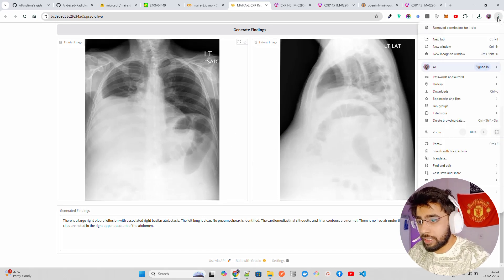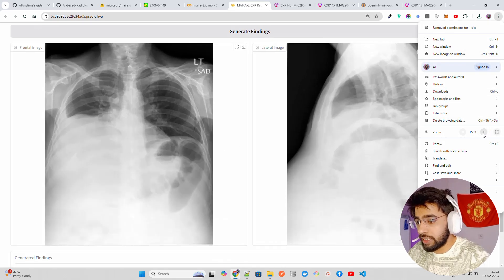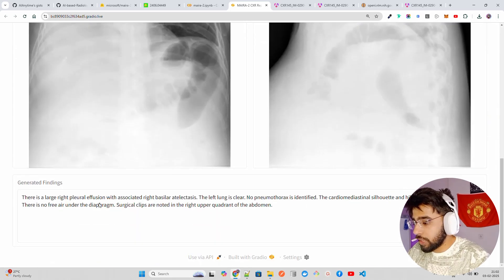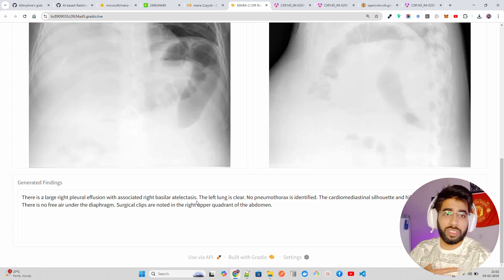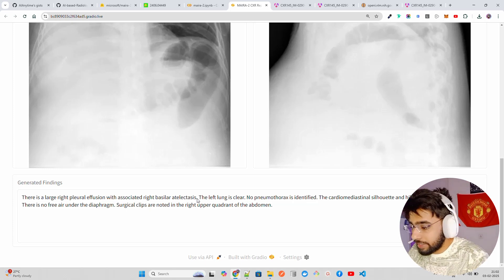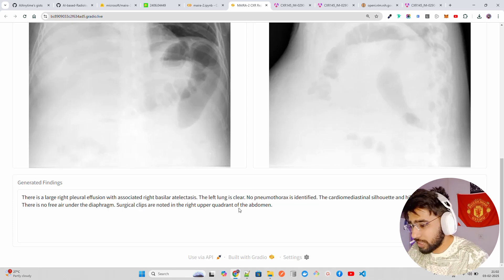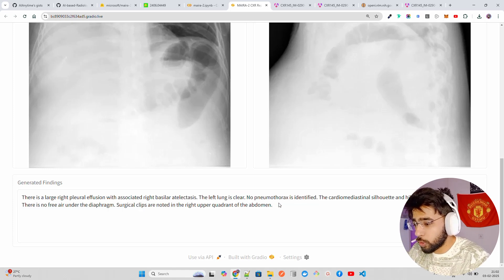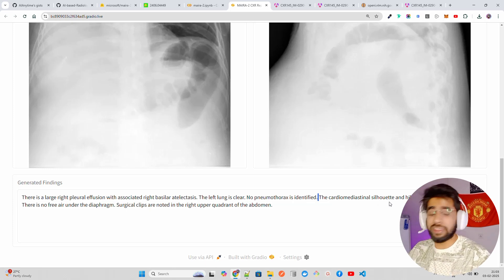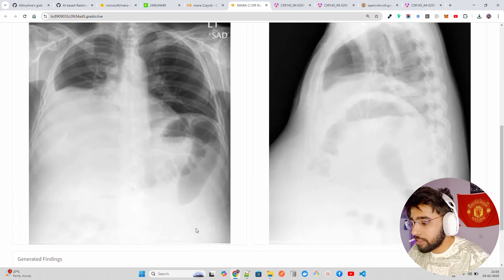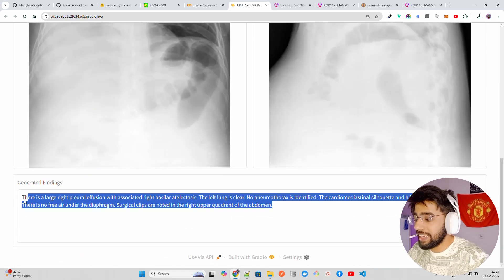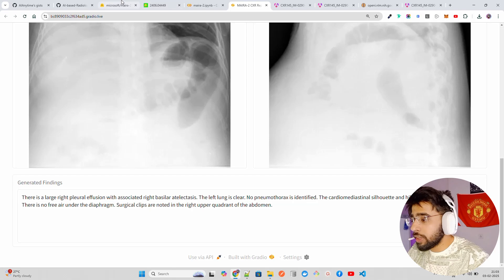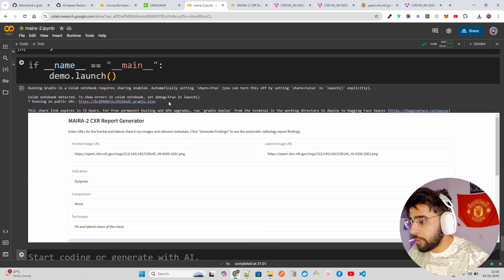If you look at the generated findings, I'll make it a bit larger for you so you can read it. You can see it says there is a large right pleural effusion with associated right basilar atelectasis or something. The left lung is clear. No pneumothorax is identified. The cardiomediastinal - it's very difficult to pronounce - but it gives you some findings. You can again increase this in your code. We have 450 max new tokens, if you need grounded generation. You can again increase this to get even a comprehensive output.